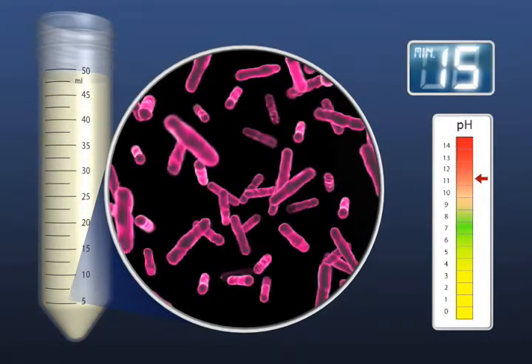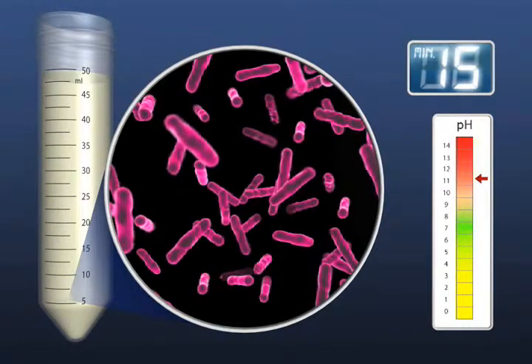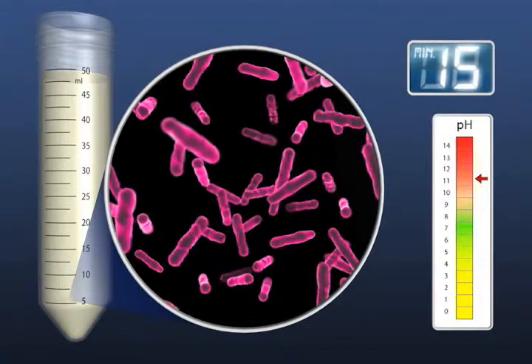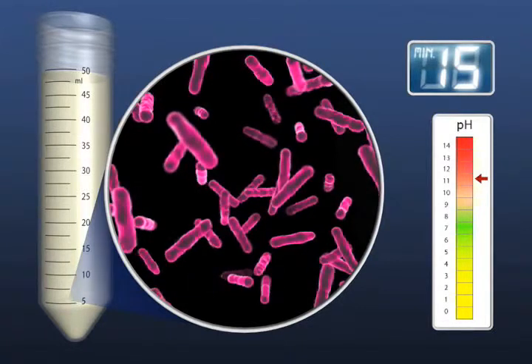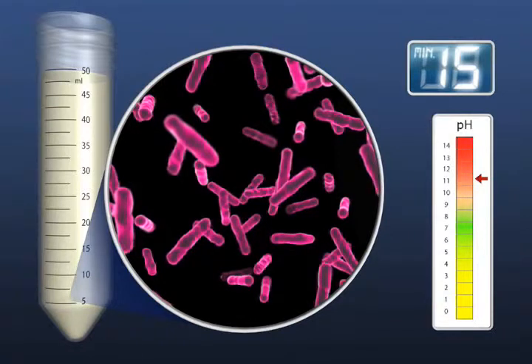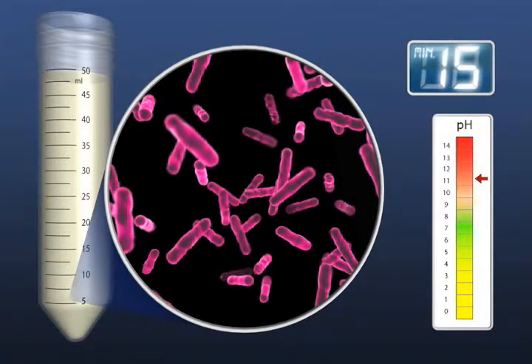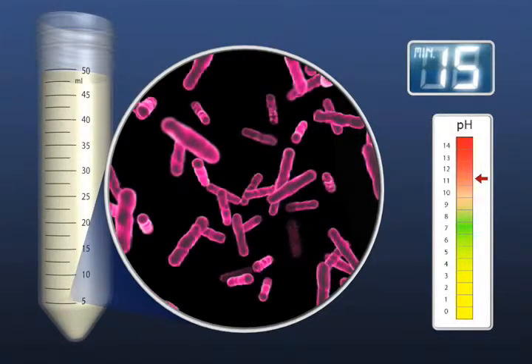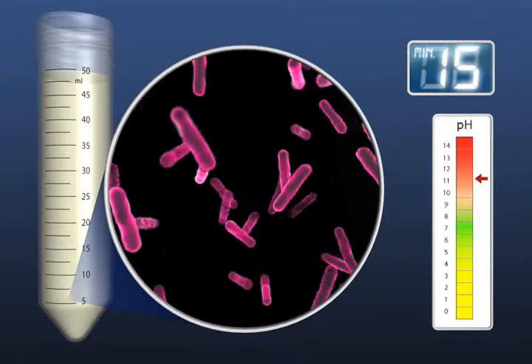One of the critical flaws in the traditional specimen preparation process is the fact that this neutralization has traditionally been attempted using M15 phosphate buffer, saline, or water. This buffer is completely unable to neutralize the basic decontaminant. This leaves the sample well above the toxic level for mycobacteria and dramatically reduces the number of viable mycobacteria available for diagnostics.